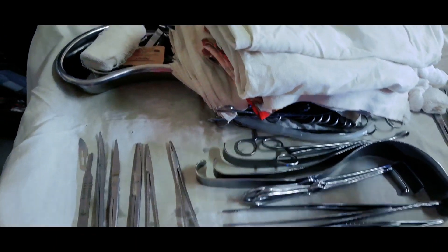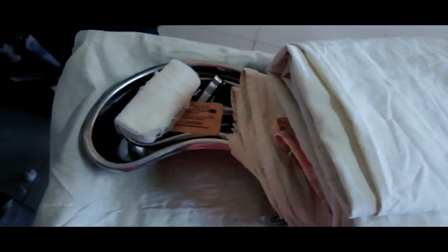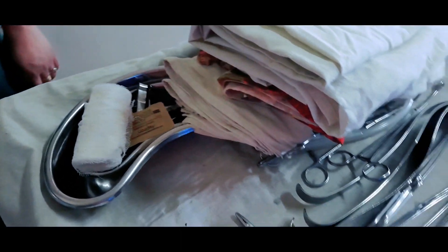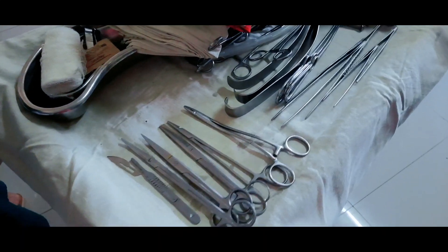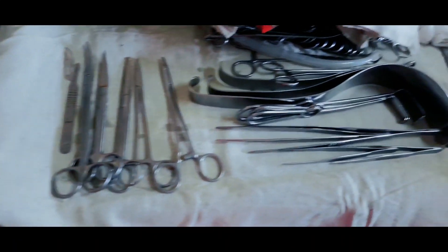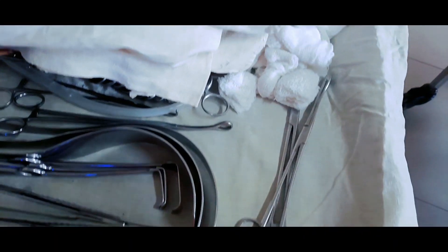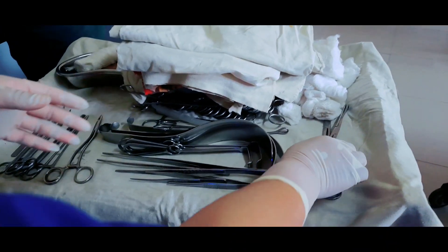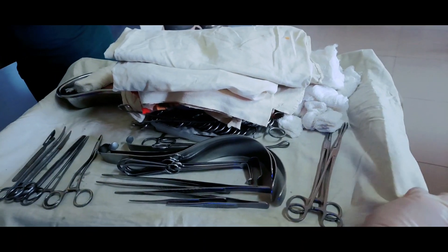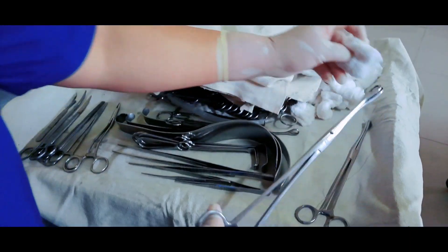This particular trolley is prepared for open cholecystectomy operation. The setting up of a trolley may differ from one hospital to another, though the instruments are the same. One most important thing is that before setting up the trolley, all the instruments which will be used for the operation have to be sterilized properly.